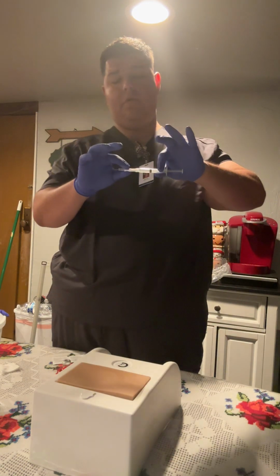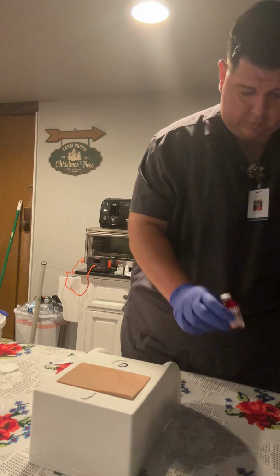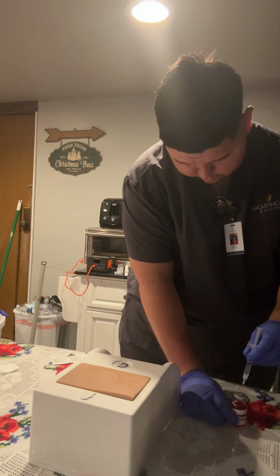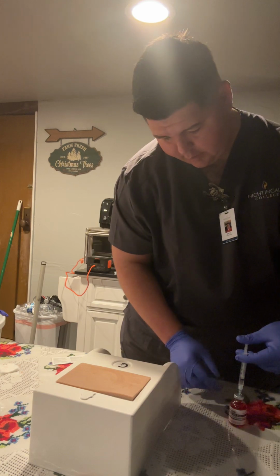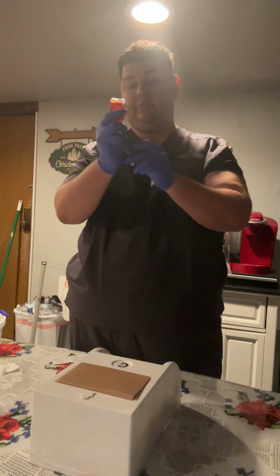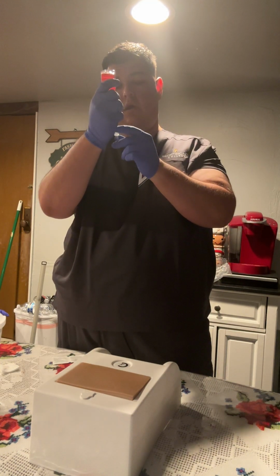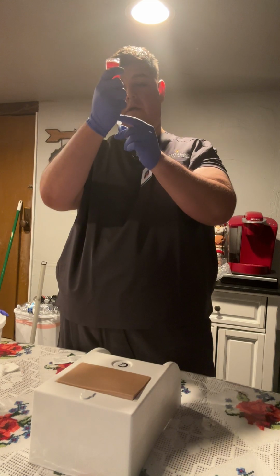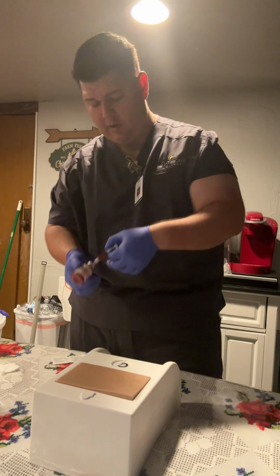I'm going to remove my cap. Take my vial, inject the air, 1.5 milliliters. Take my vial, invert, and we'll draw the 1.5 milliliters back of the solution. All right, that's on.